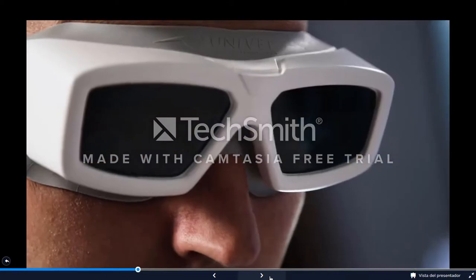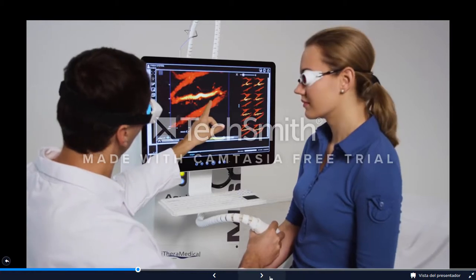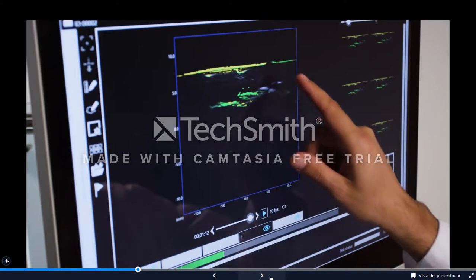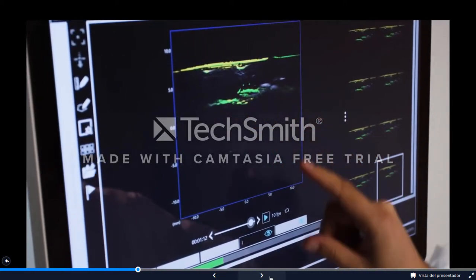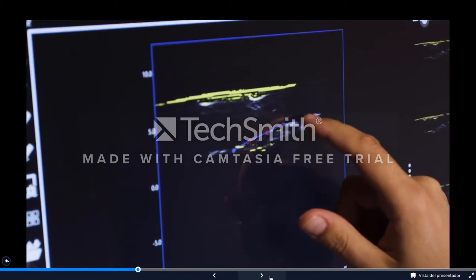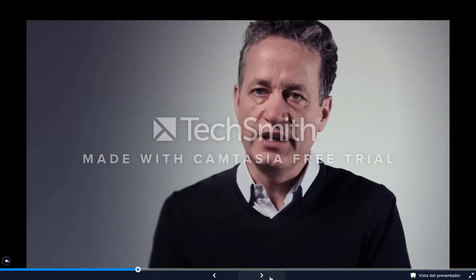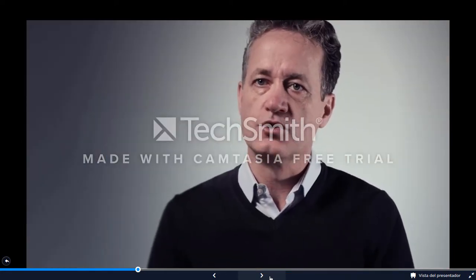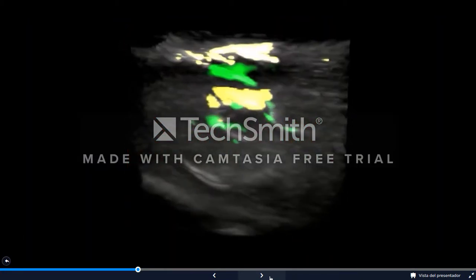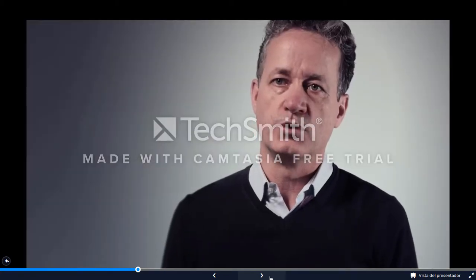It allows us to detect and quantify the presence of chromophores in tissue, including hemoglobin, melanin, lipids, water, and various contrast agents. Initial patient studies have shown promising results for a variety of applications, including breast, skin, and thyroid cancer. We are convinced that the ability of MSOT to show molecular optical contrast at high spatial and temporal resolution will make it a valuable diagnostic tool in the future.